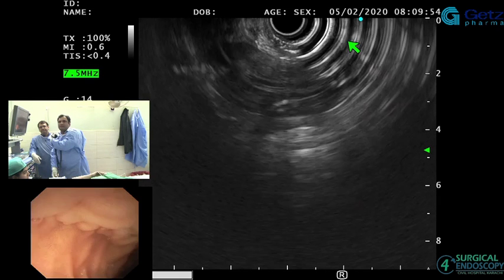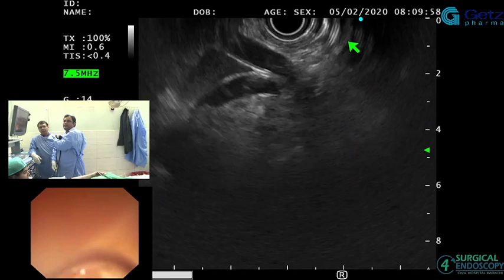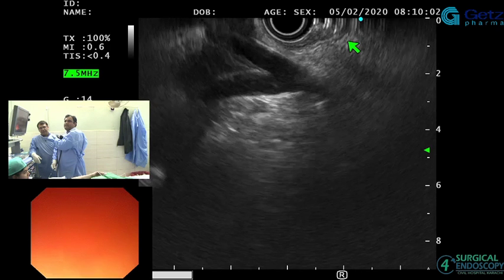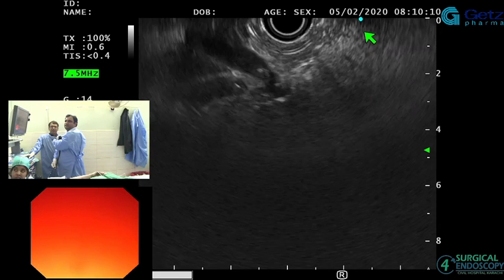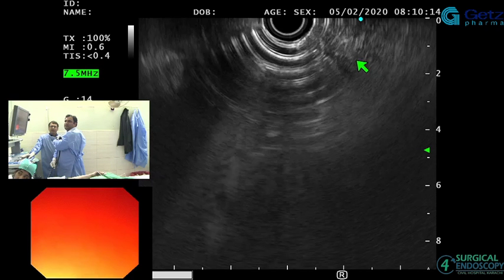Okay. Aorta, you went back in there. Okay. IVC right there. Let's rotate from the aorta, rotate to the right. Looks like it's coming up here. We have to be able to maintain that. Good. That's the uncinate process, it looks like. Right there, this is all pancreatic tissue. Good. Keep pulling back.